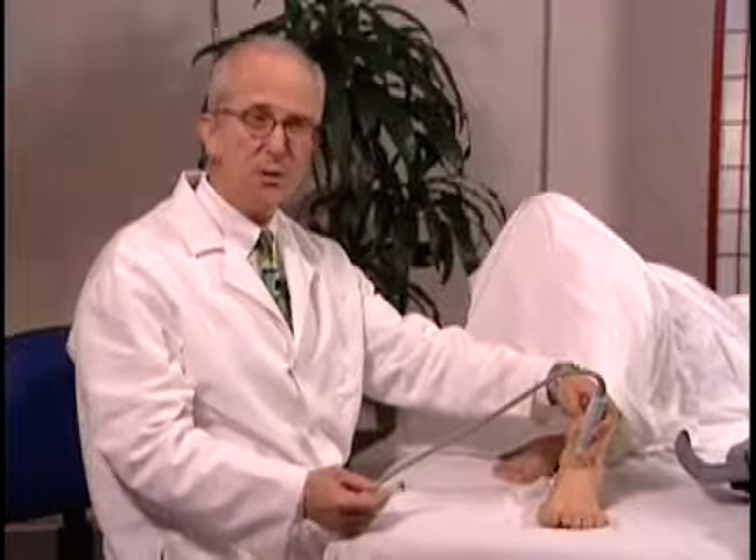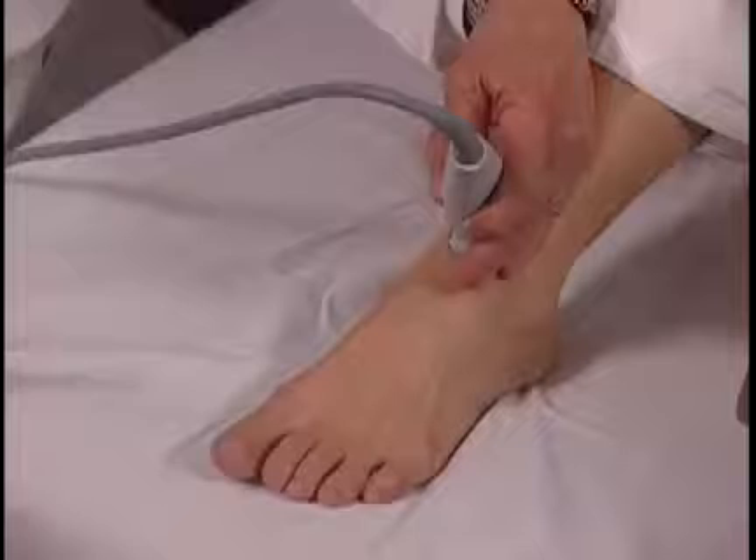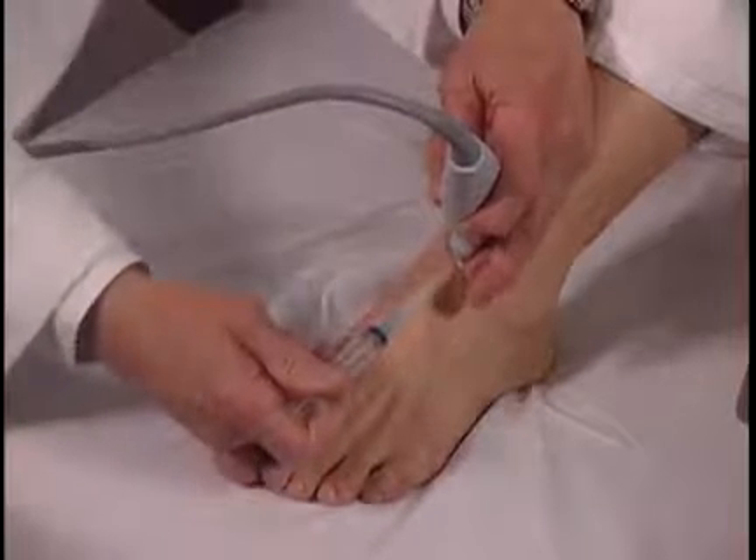This can be approached with a needle and syringe using sterile technique. Obviously here we do not have sterile gel or sterile preparation — it's just for demonstration purposes. The needle can be placed in this way.